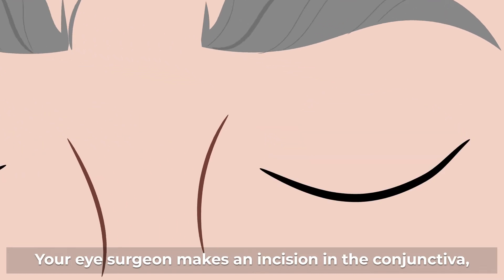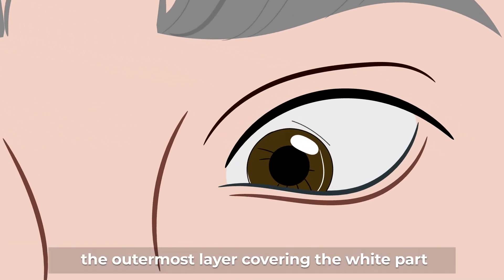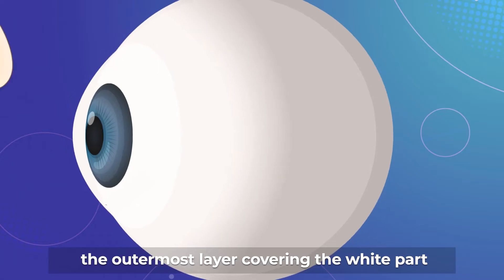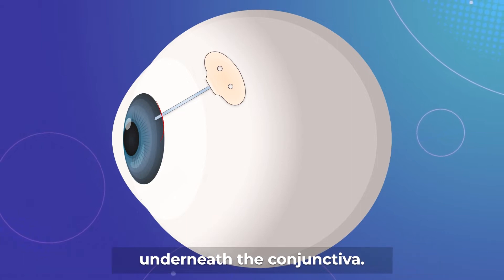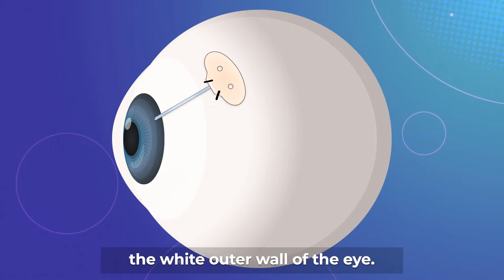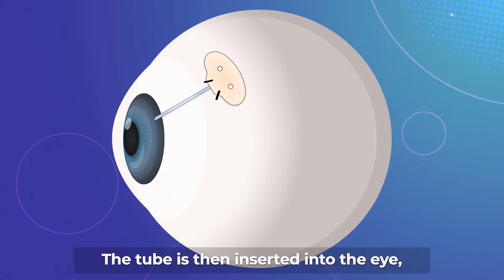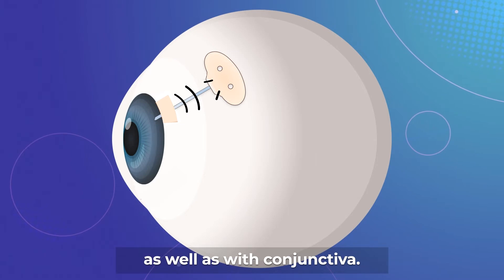Your eye surgeon makes an incision in the conjunctiva, the outermost layer covering the white part of the eye. This allows the tube implant to be inserted underneath the conjunctiva. The plate is stitched to the sclera, the white outer wall of the eye. The tube is then inserted into the eye, stitched to the sclera and covered with a patch as well as with conjunctiva.